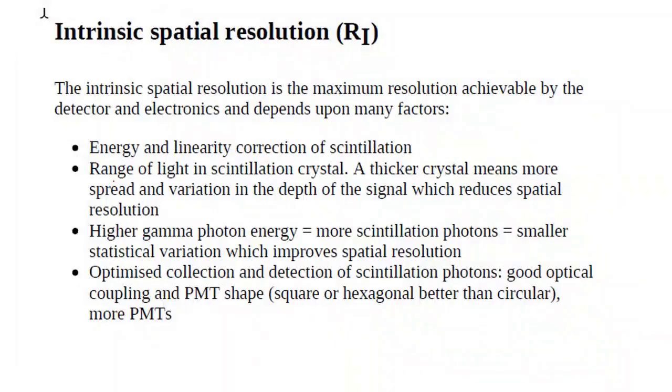For instance, you tell it that a certain source with an energy of 140 kiloelectron volts will come, and it will produce a scintillation flash with a certain photon output. Now, you know that this energy, which the detector encountered in relation to this photon, corresponds to the 140 kiloelectron volts of technetium. This process is called calibration.